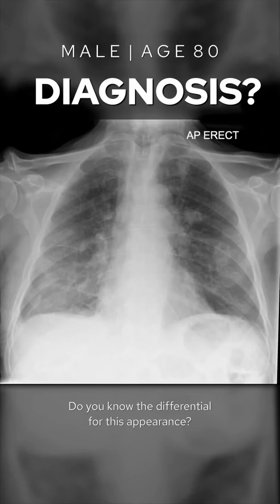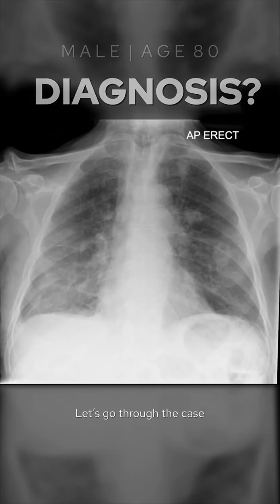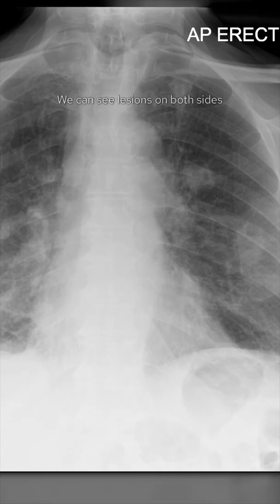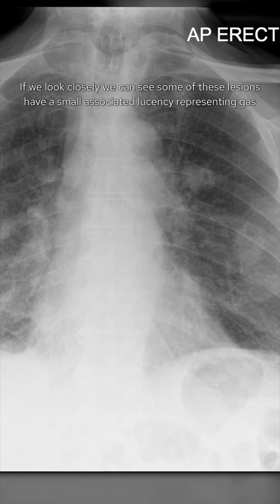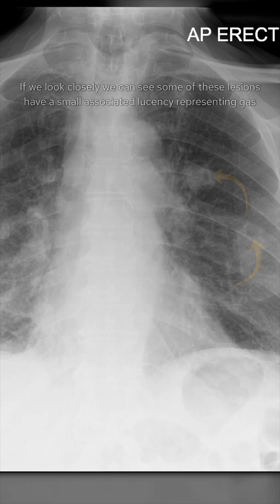Do you know the differential for this appearance? Let's go through the case. We can see lesions on both sides of the lung. If we look closely, we can see some of these lesions have a small associated lucency representing gas.